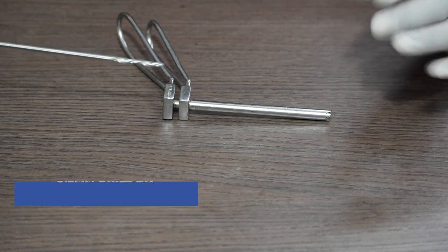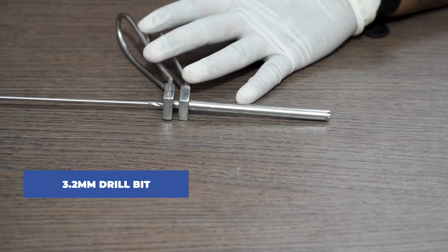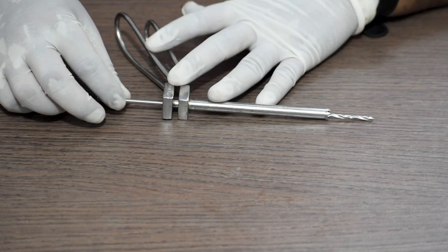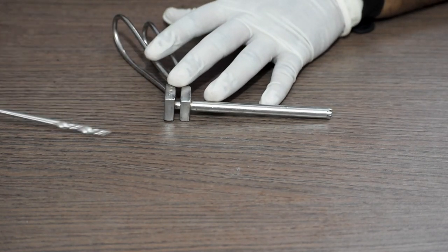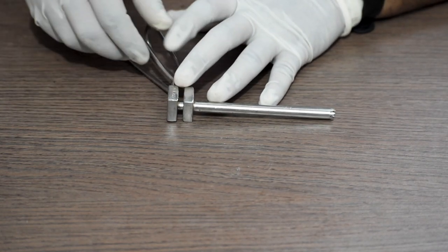First, we will use a 3.2 mm drill bit. After this, we remove the drill bit along with the drill guide.